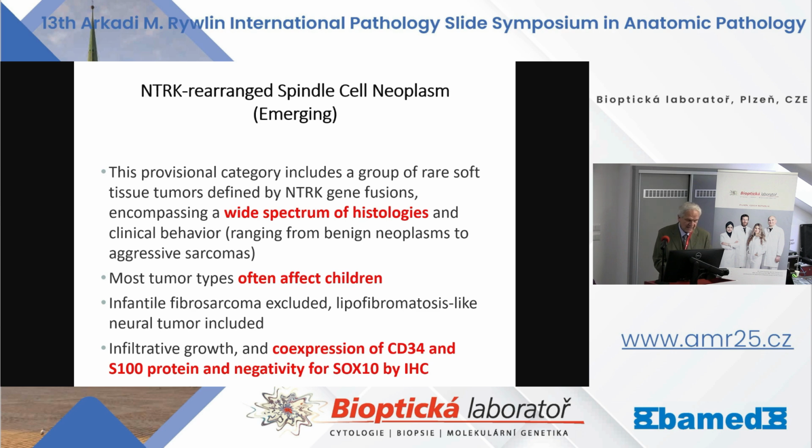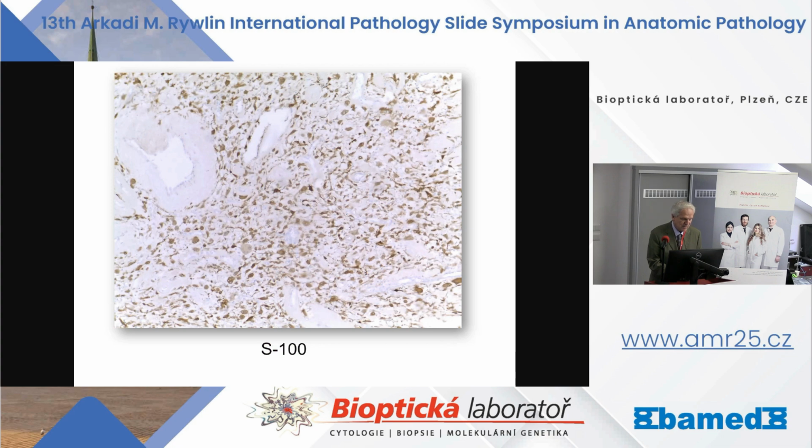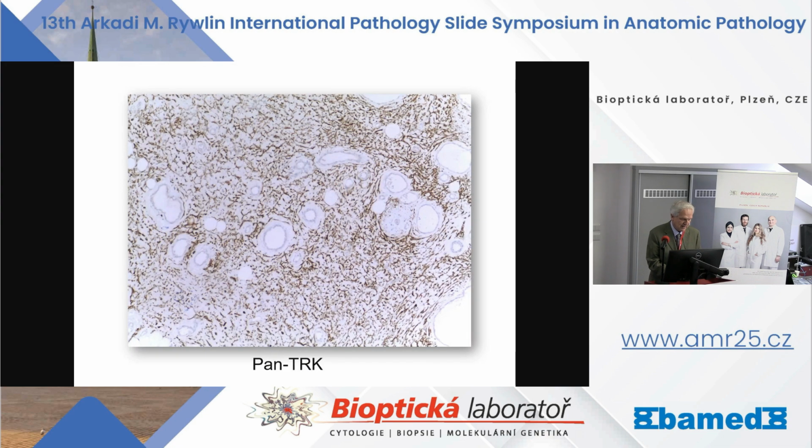The important thing is the co-expression of CD34 and S100 and negativity for SOX10. And here in another field, CD34 and S100 are positive, and pan-TRK positive.